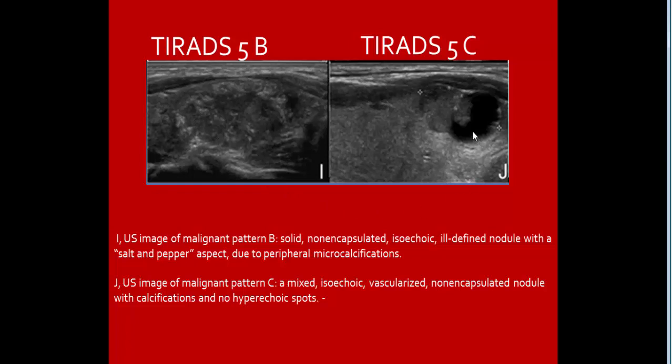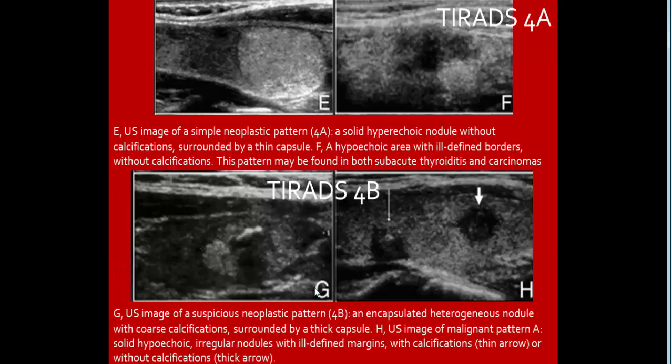TI-RADS 5C, image of malignant pattern C: mixed isoechoic vascularized non-encapsulated nodule with calcification, no hyperechoic spots.